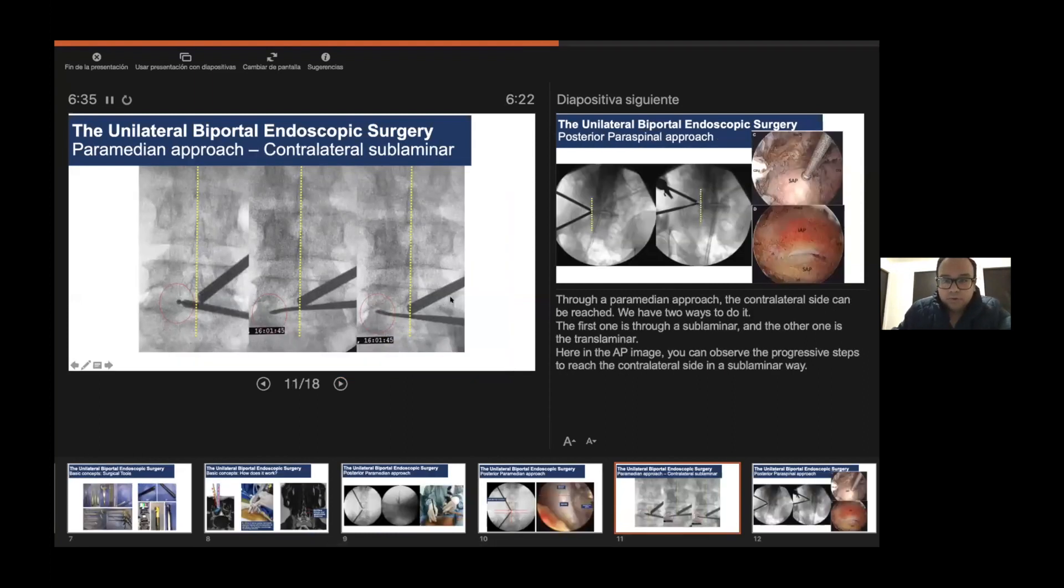Also through the paramedian approach the contralateral side can be reached. We have two ways to do it: the first one is through the sublaminar approach and the other one is the translaminar approach. In these pictures you can observe the progressive steps of how I can get to the contralateral side through a sublaminar approach.